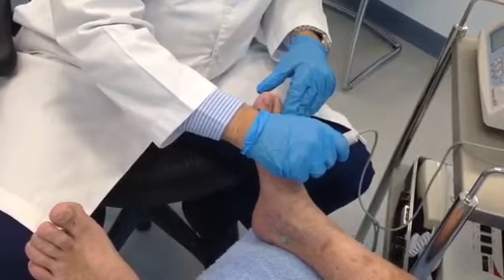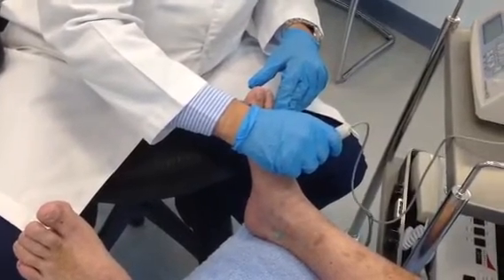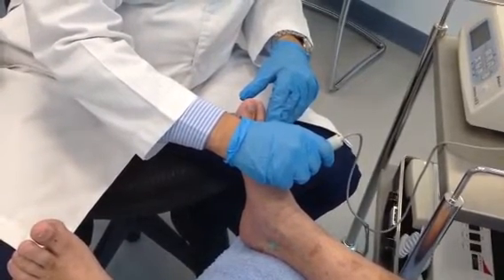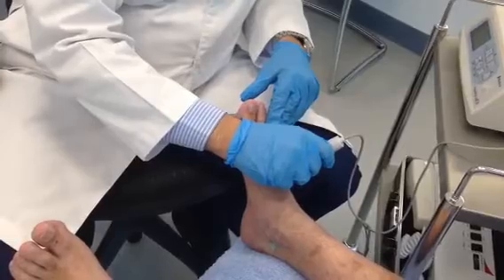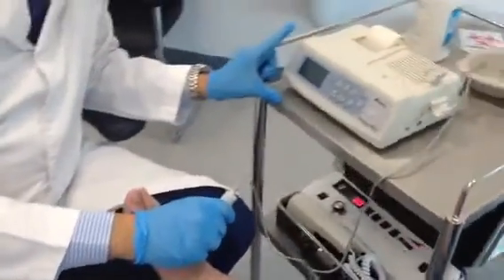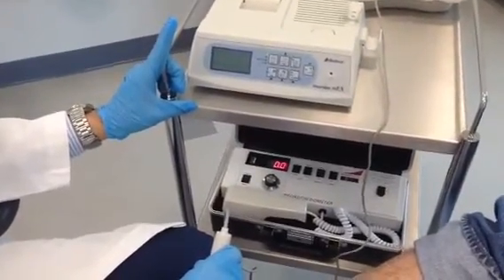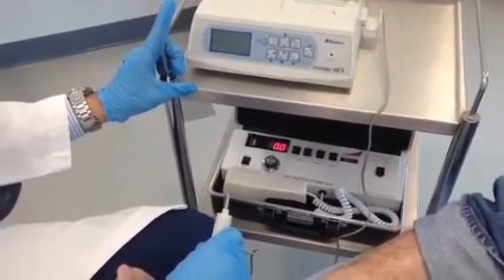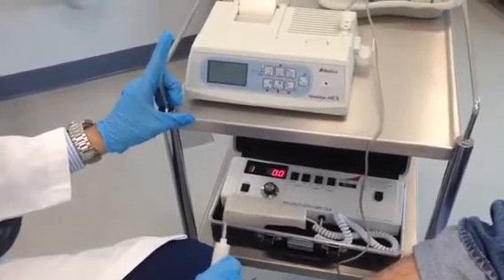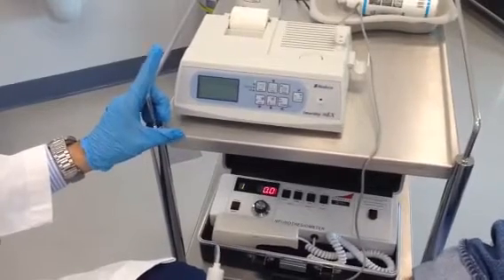This is the dorsalis pedis pulse on the right foot. The sound you hear is biphasic — two sounds — that indicates the elasticity of the arteries, and you can see the graph here showing good pulsatility. On the graph it's even triphasic, which indicates perfect elasticity, while the sound is biphasic.